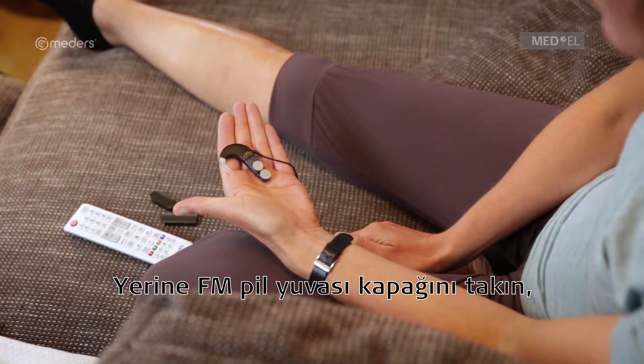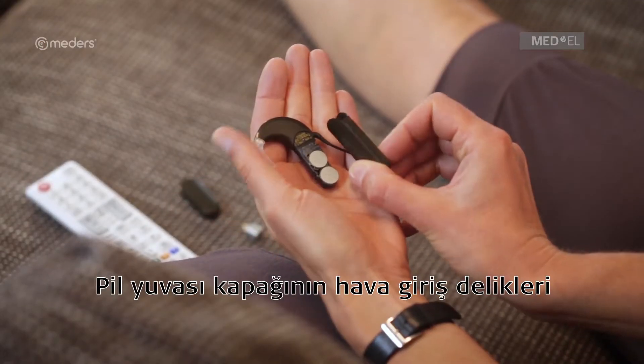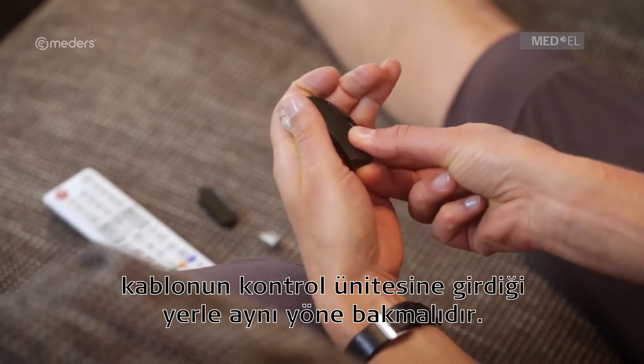Slide the FM battery pack cover over the battery pack frame and be careful not to use excessive force. The air inlets of the battery pack cover should be on the same side as the coil cable socket of the control unit.